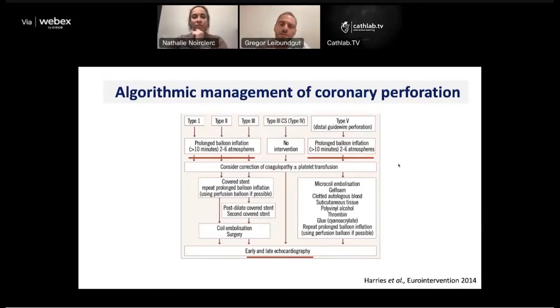And in our case, we saw it coming out from the coronary sinus. Eventually all the blood comes out from the coronary sinus, but it's more about timing. Once you inject and it comes early, then you know it's a coronary venous fistula. So that's how we checked in our case, and then you can leave it before using coils and everything.